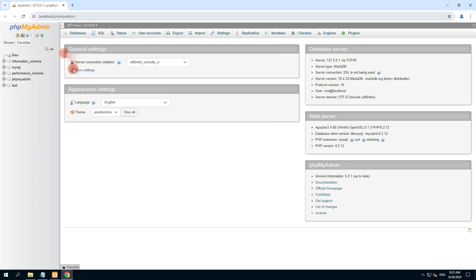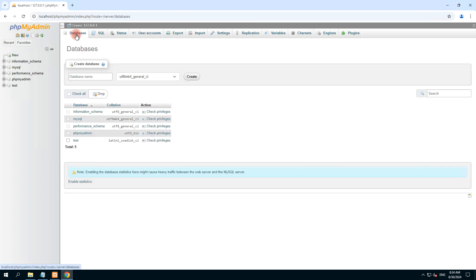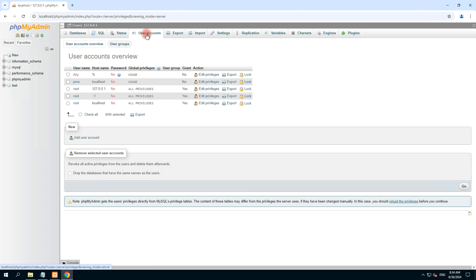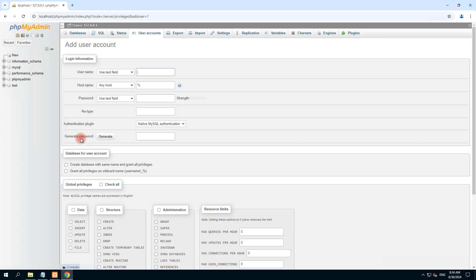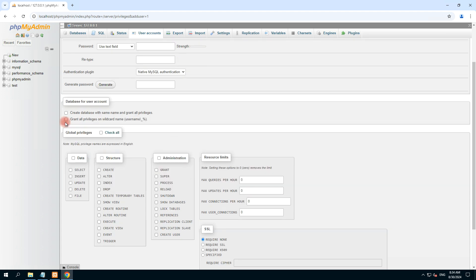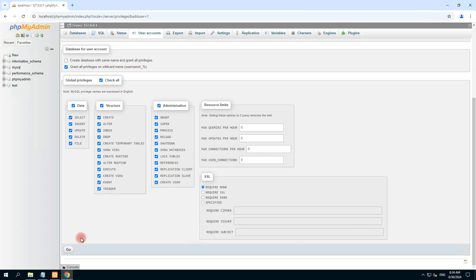In phpMyAdmin we can easily create the database via this phpMyAdmin portal. First we need to go to the database. These are already set-up databases. First we need to create the user account with super privileges with the name 'pacs'. So click on user — create a new user account. The username is 'pacs'. No password — password should be blank. Grant all privileges and global privileges — check all.